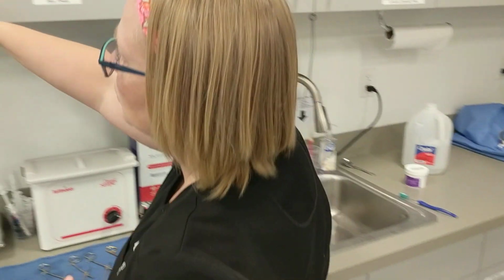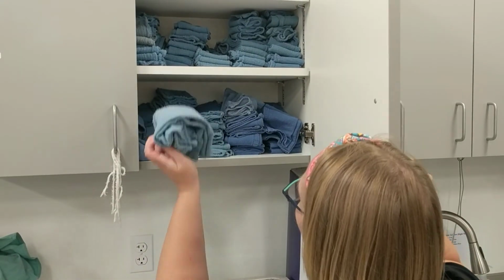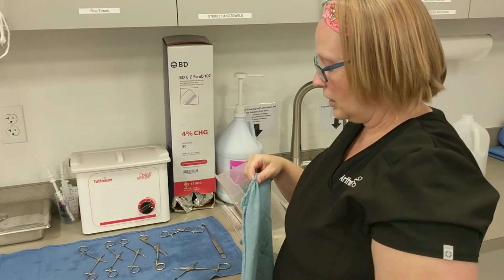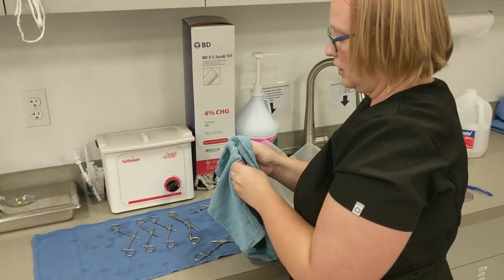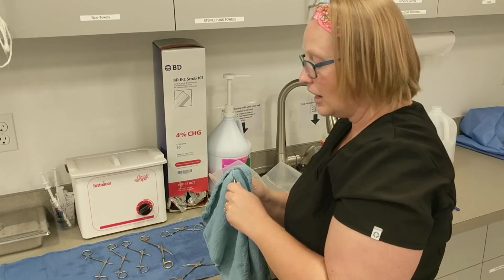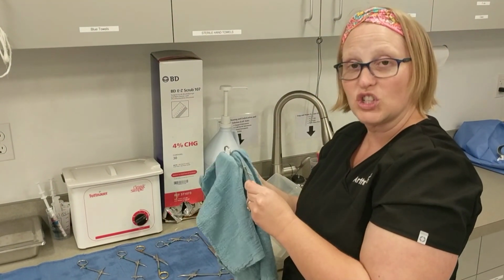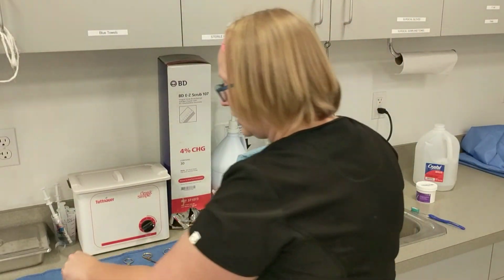From here, if I was in a hurry to re-rack them right away, I would go ahead and take another towel, and we could actually hand dry these. But I would like to leave them sitting for a little bit so these joints have a chance to dry and have that lubricant really be in there.